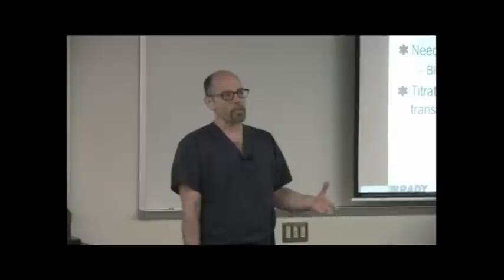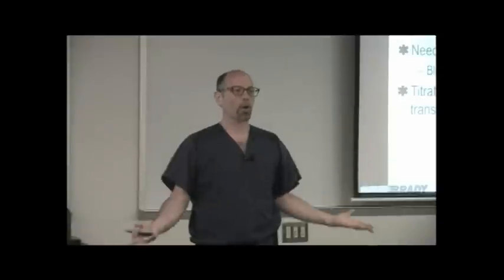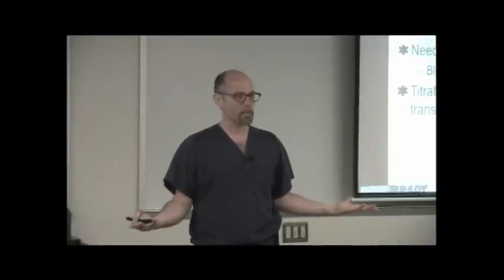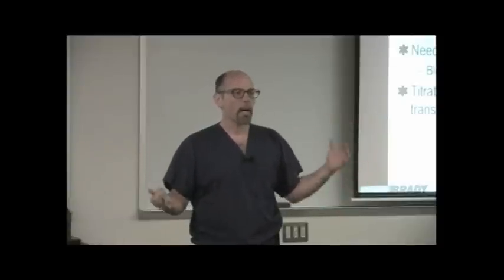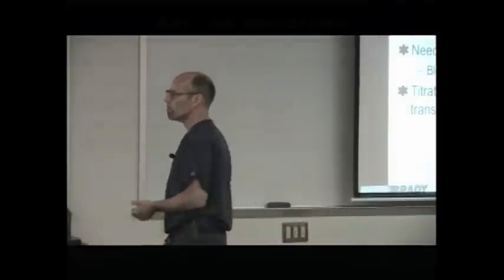Old school physicians, cardiologists in particular, because how is a patient positioned in the cardiac cath lab? They're flat on their back. They're never sitting up. In their world, that's how transducers are leveled and zeroed. They're the ones that are most stickler about it. In reality, as I said, I can provide you with all the literature that you want if you'd ever care to see it, that patients, as long as they're supine, can be as high as 30 degrees, and it's still safe to level and zero that transducer at that level. So you don't have to get all freaked out about that, all right? Good question.